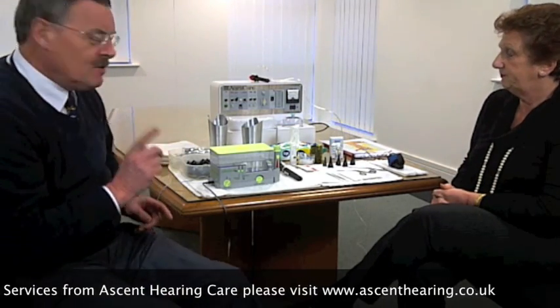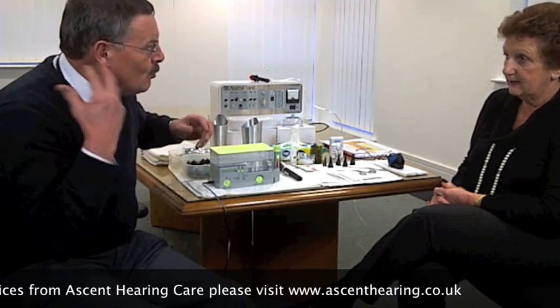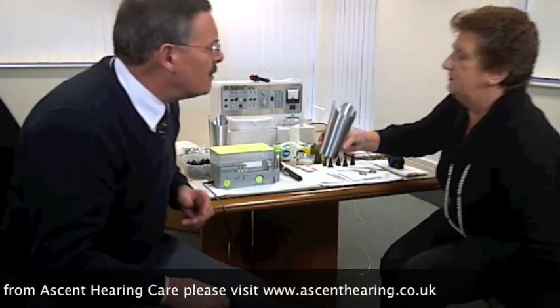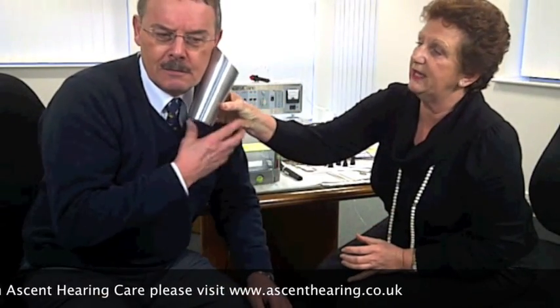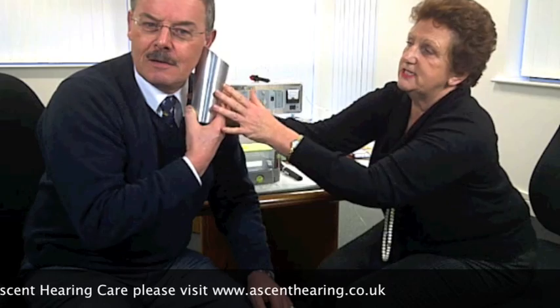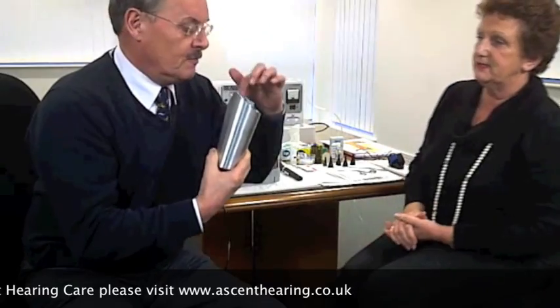Just one thing I was thinking about — when you're squirting this water in my ear, what happens to the water? Where does it go? We get the patient to hold a tank — a kidney tank — just underneath the ear, and any water and debris will go into the tank.